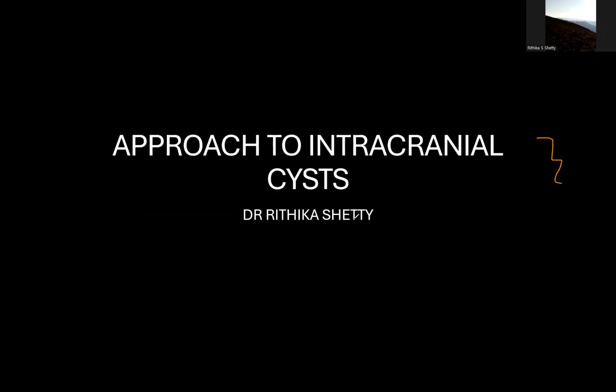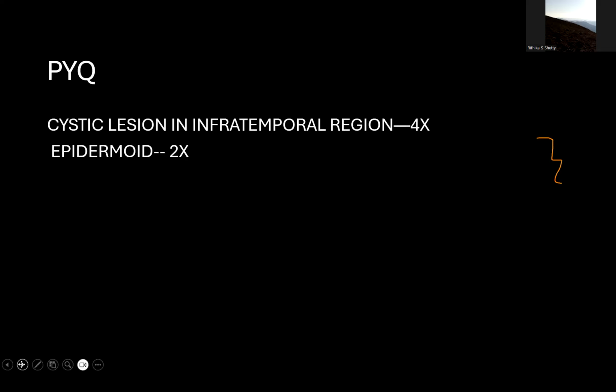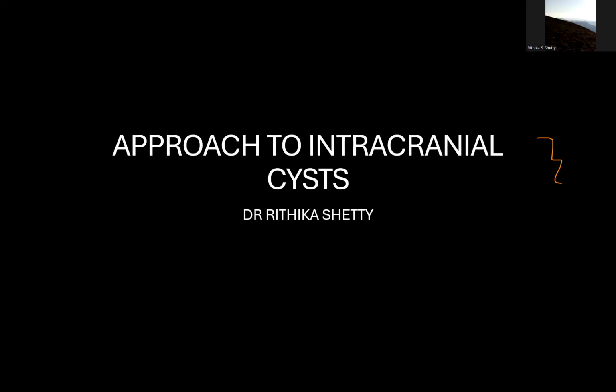My topic is approach to intracranial cyst. A previous year question from this topic is cystic lesion in infratemporal region, and twice a question was asked on epidermoid cyst. My topic is a continuation of our brain tumor series only, like we had finished supratentorial, infratentorial lesions.